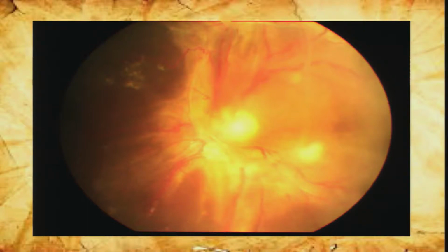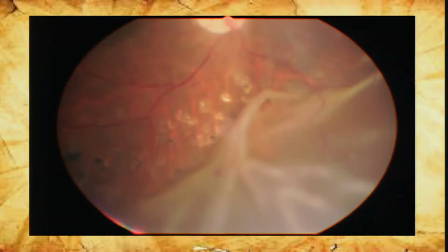This is a typical photograph of a combined retinal detachment. One may not always be lucky to see the break, as can be seen in this patient. This is a wide-angle view of the same.